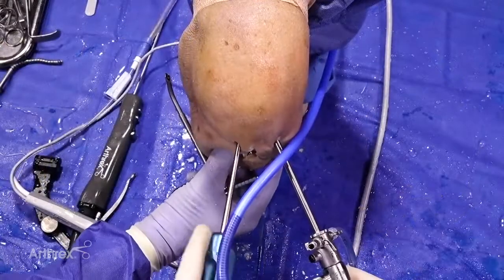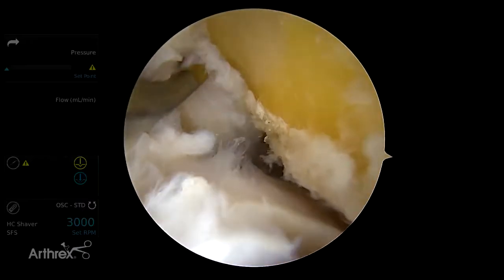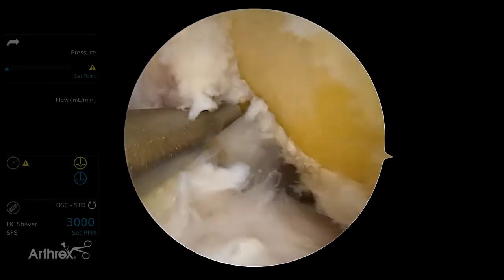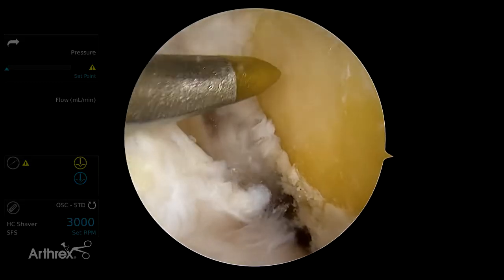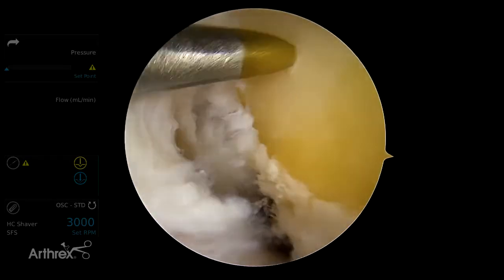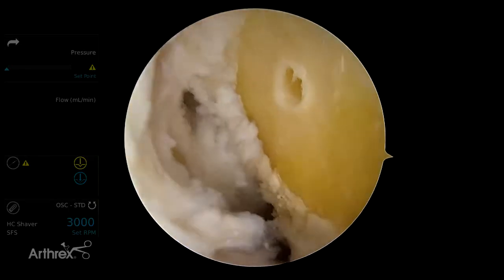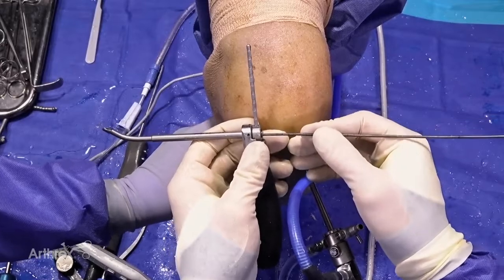At this point I'll use a microfracture awl — typically a 45 degree — to mark the position of the femoral socket. We're going to drill a 10 millimeter tunnel today, which requires roughly a one to two millimeter back wall, so we're going to put this about six to seven millimeters anterior. This briefly marks that position and gives us a starting hole which facilitates passage of our wire.